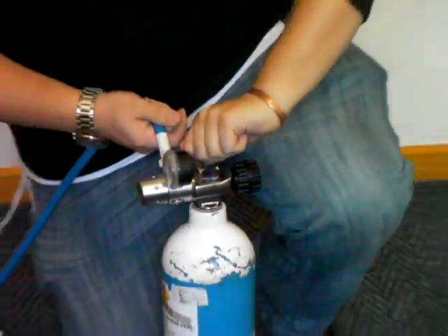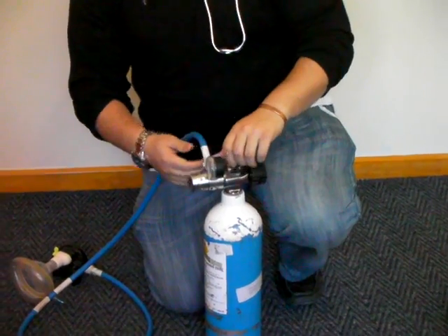Open it up. Check here if there's any leaks.